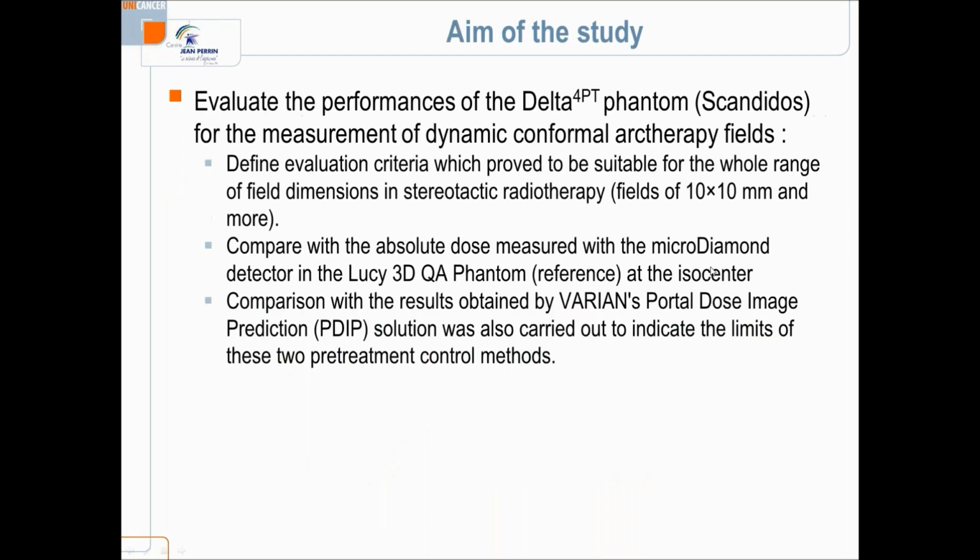So the aim of this study is to evaluate the performance of the Delta4 Phantom from Scandidos for the measurement of dynamic conformal arc therapy fields. And we were then able to define evaluation criteria which proved to be suitable for the whole range of field dimensions in stereotactic radiotherapy, so fields of 10 by 10 millimeters and more.